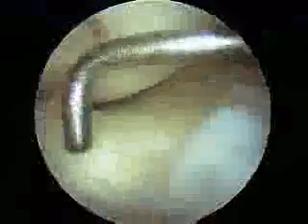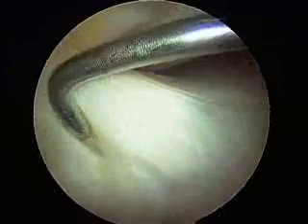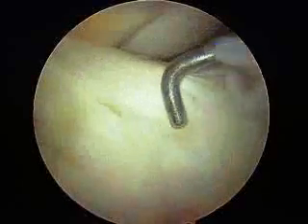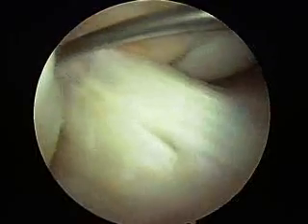The anterior is intact. The only thing, it looks like it may have been sprained right there, but that does not have to be repaired. Only when the tendon is torn completely across like that do you repair it. So this is nothing that has to be worried about, nothing that has to be repaired. But you can see it attaches here at the anterior portion of the anteromedial portion of the tibial plateau, and it goes up and attaches in the medial face of the lateral femoral condyle, right up in there.